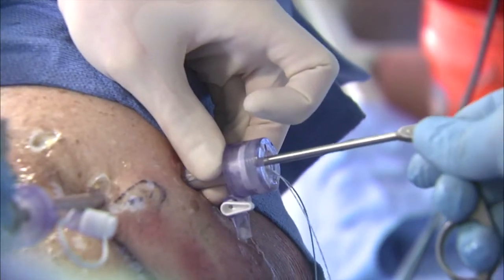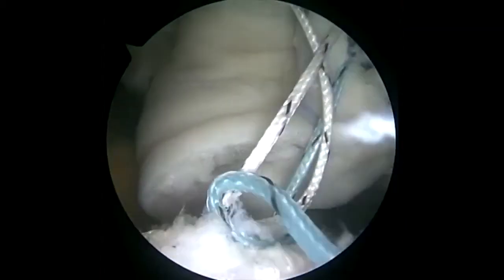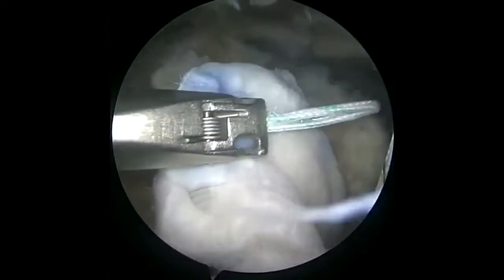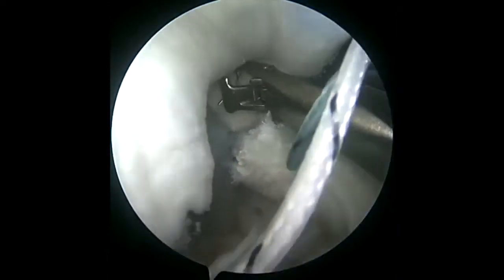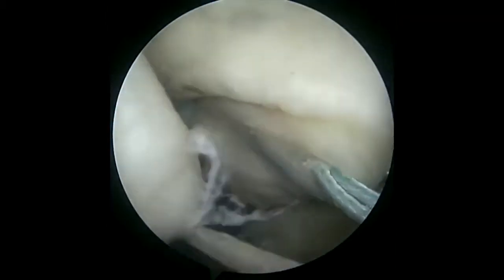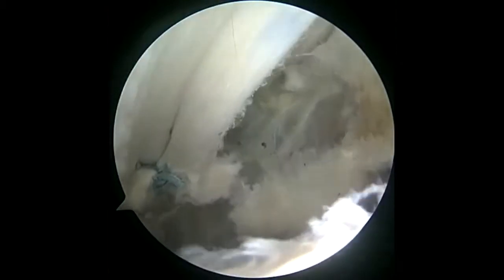The graft is then rolled, and the grasper is used to insert it through the cannula at the mid-glenoid position by pushing the instrument into the shoulder. The lateral graft is secured using the double row SutureBridge technique. Before that, a temporary suture may be used for graft positioning and tensioning. The glenoid anchor limbs are then pulled from the mid-glenoid portal and tied to each other.